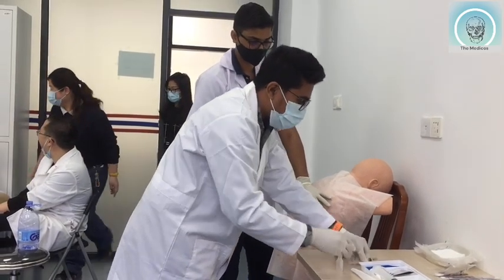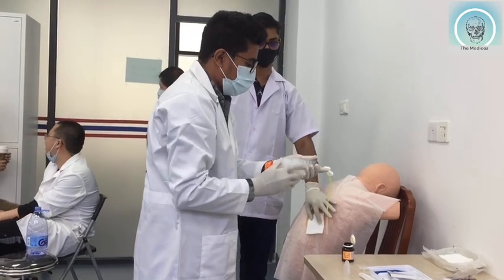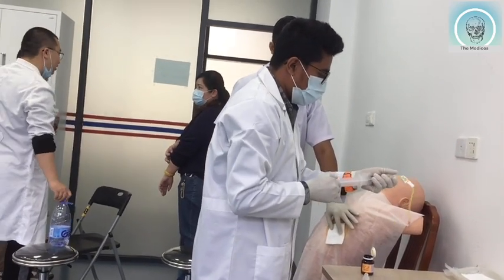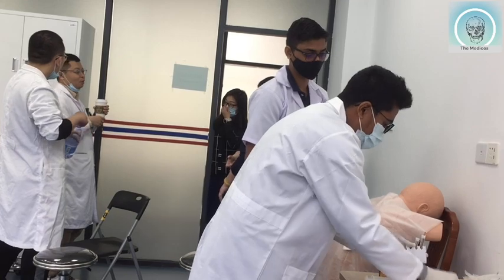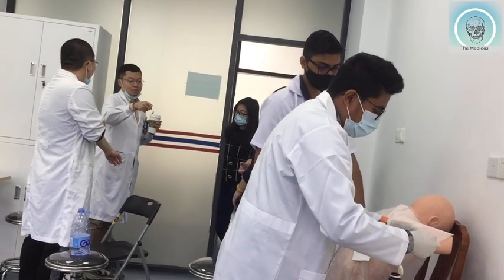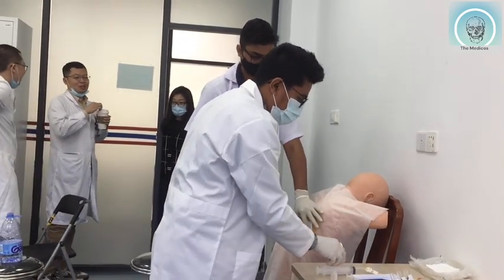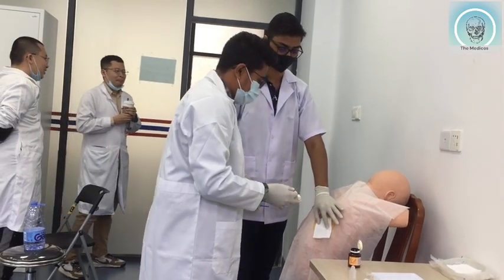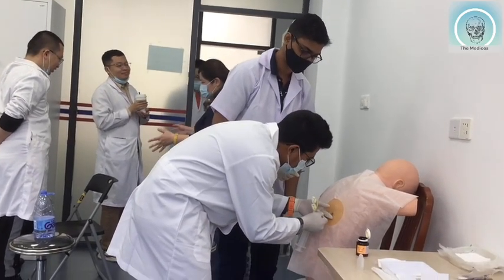By doing laboratory tests on the pleural fluid, the cause of the pleural effusion can easily be determined. Before a thoracentesis, a chest ultrasound will be done to identify the exact location of the pleural effusion, and it is preferred because it is more accurate in determining the location of the effusion. The doctor will explain the procedure, describe potential complications, and discuss why thoracentesis is necessary. If you have a bleeding disorder or are on medications that affect blood clotting, you may need extra care to minimize the risk of bleeding. In some cases, a blood test will be taken before the procedure to exclude any blood clotting abnormalities caused by diseases or medications. In most cases, a thoracentesis is performed without complications.